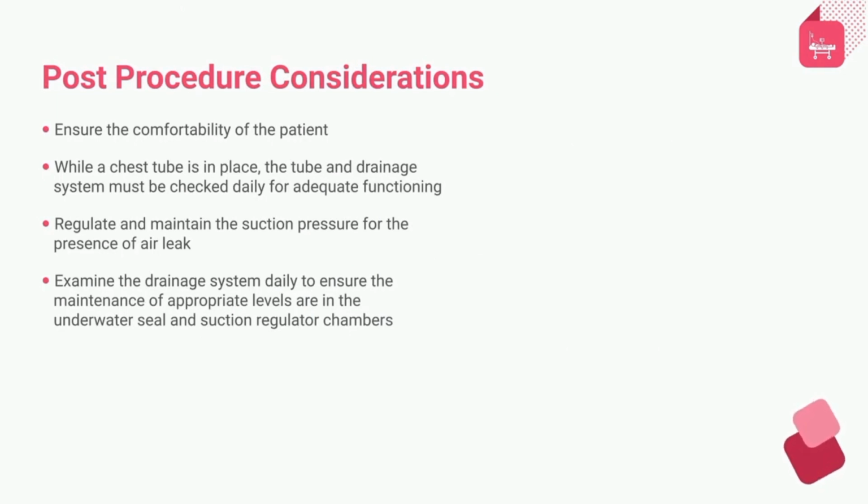Let us now understand the post-procedural considerations. Ensure the comfortability of the patient. While a chest tube is in place, the tube and drainage system must be checked daily for adequate functioning. Regulate and maintain the suction pressure for the presence of air leak.